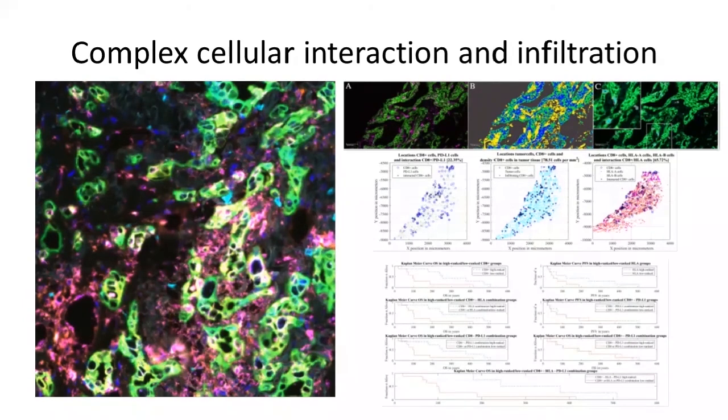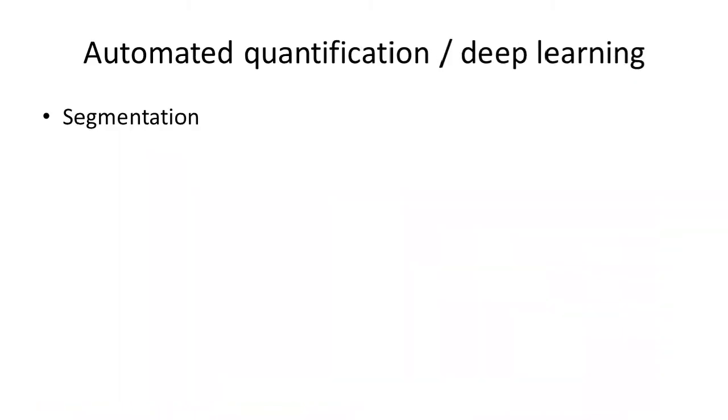And of course, it would be great if we could combine all of those markers into a single multiplex image, and that's what we've recently done by using PD-L1, cytokeratin, as well as CD8 and markers for immune cells. You can then deconvolute this slide, do additional analysis on this, and actually look for nearest neighbor analysis, for instance, and co-localization, and then combining all of those, you have at least as good a predictive value of response to immunotherapy as when you combine all of those after having done single plex stains.